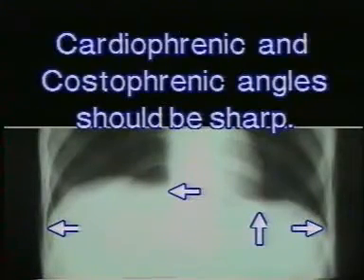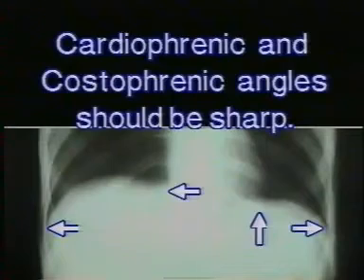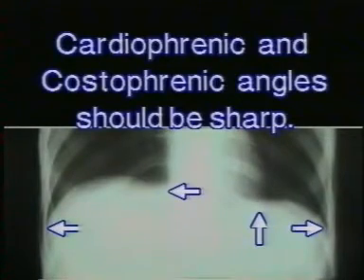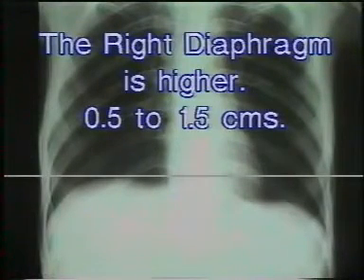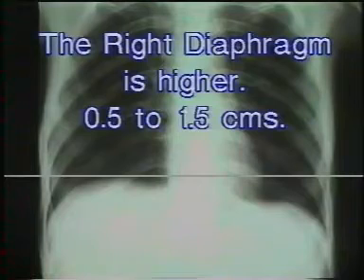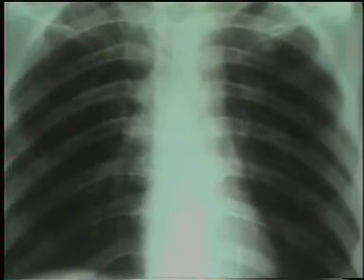Then inspect the cardiophrenic and costophrenic angles — they should be sharply defined. Any obliteration of any of these angles is pathological. The right diaphragm should be 0.5 to 1.5 cm higher than the left diaphragm, and both should be smoothly curved.